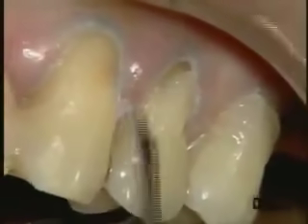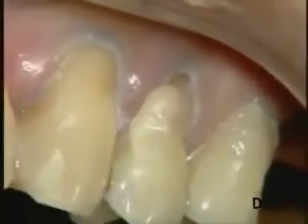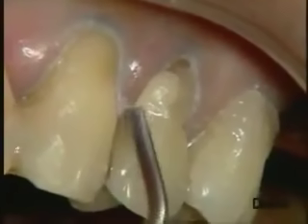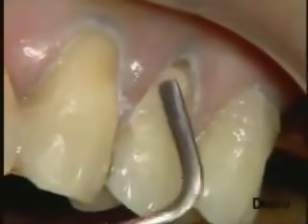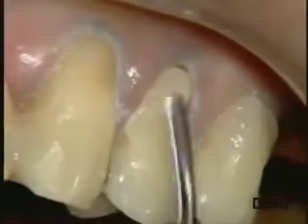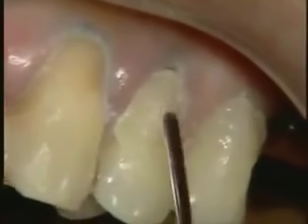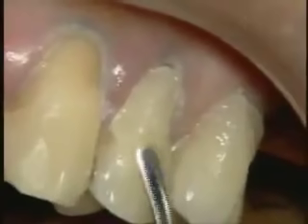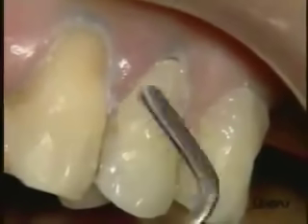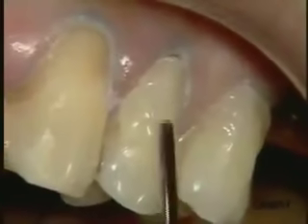After curing the first layer, we continue in the same way. You should note the importance of this stage to avoid gingival fluid that could cause cohesion deficiency between the layers of material. You can already appreciate the appearance of the shades on the two premolars that perfectly match the shade of the crowns. You see that we remain slightly below the cervical margin.